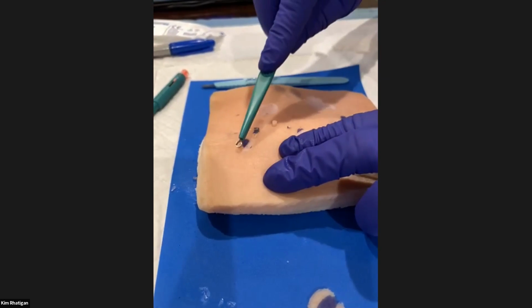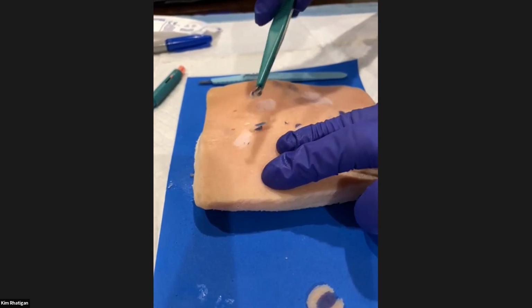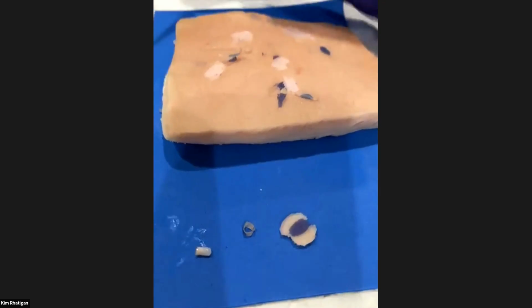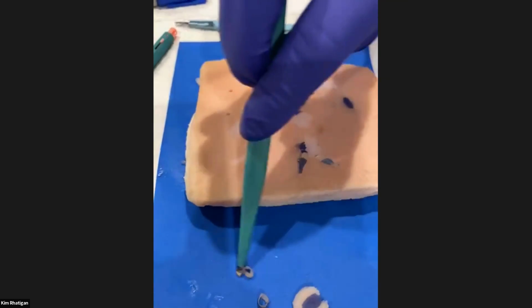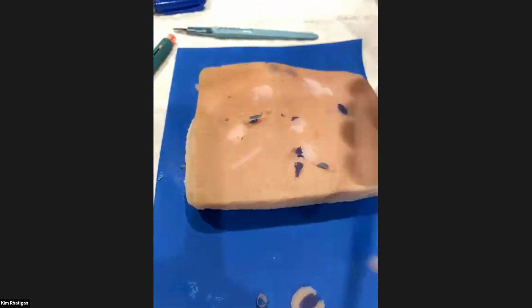Oh, look at that. That is like a paint roller on a wall. That's beautiful. You get these nice thin little slivers. That is like a wisp of a shave. If I had to choose, I think I'd pick this tool. I feel like I have better control over it.